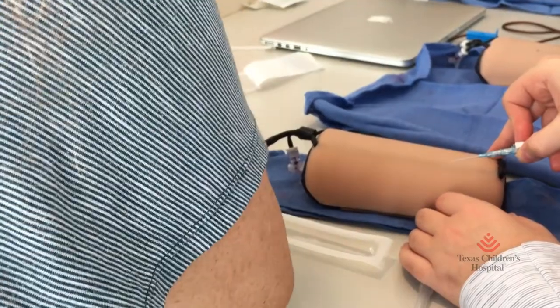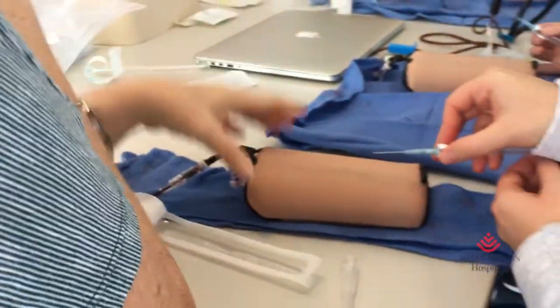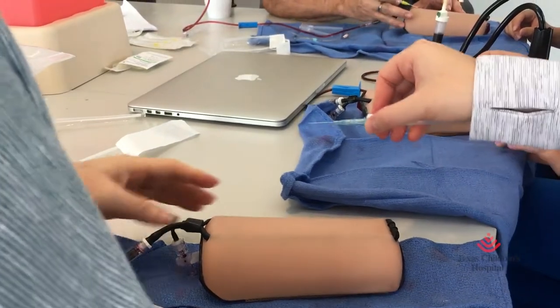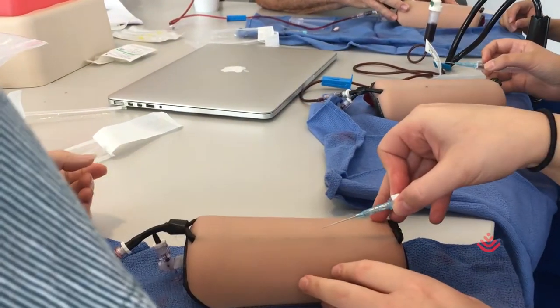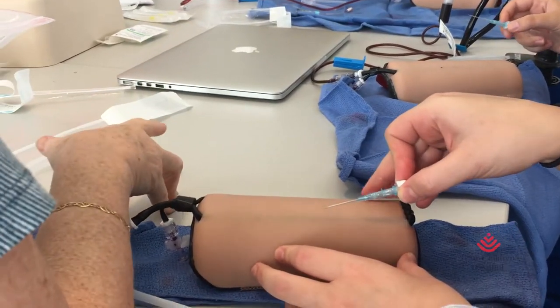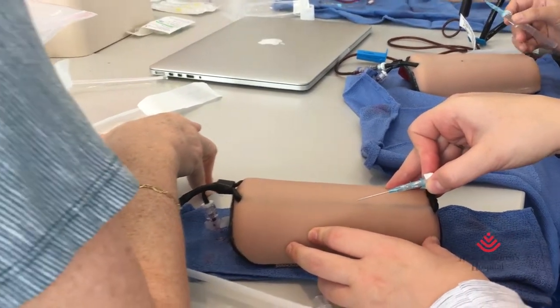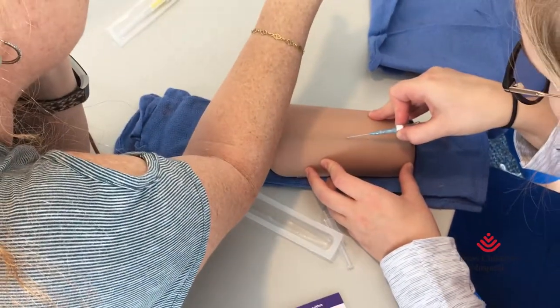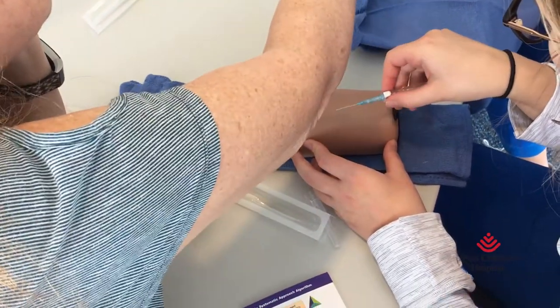Fingers on each side — that's what the grooves are for. You want to line up your patient, don't line up yourself. Make your patient fit to where you're going to need to be more comfortable. Use your three fingers on the outside to rest on your patient, with your two fingers up on the cap there. It's not a dart — go over the top.